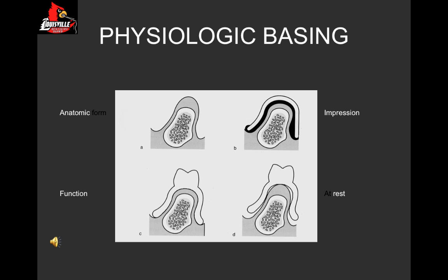What actually happens on this denture is that at rest, the denture is positioned upward and away from the bony support area in the lower right picture. When the patient occludes the food, then the denture would depress and it would look again like the lower left-hand side.